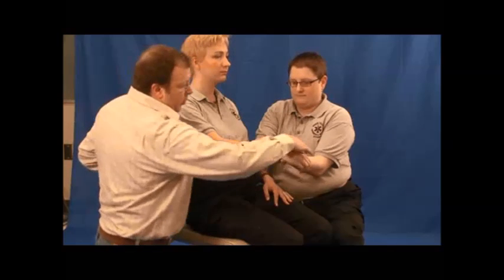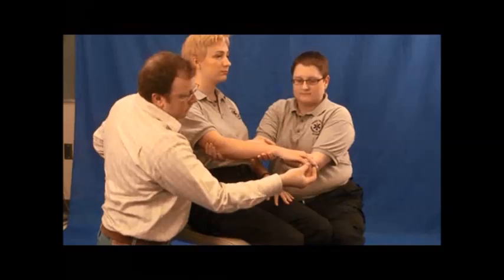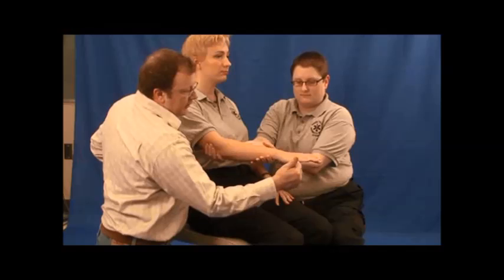Stabilize it. Check pulse, motor — can you move it? — and sensory — can you feel this?